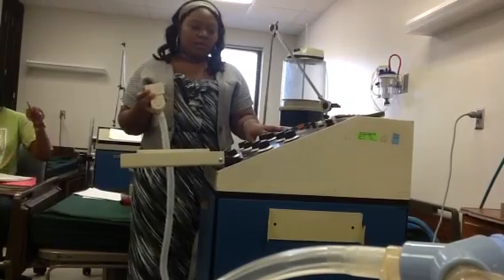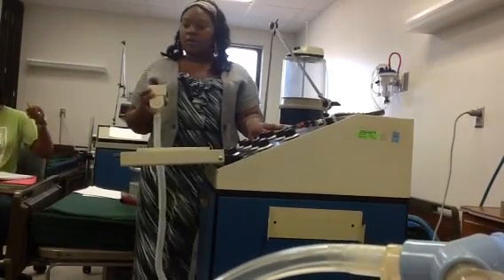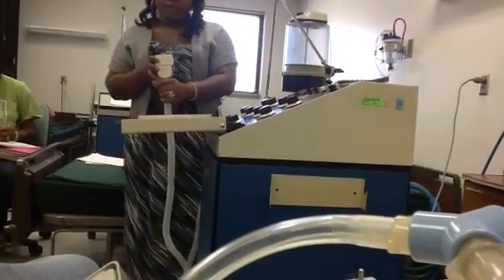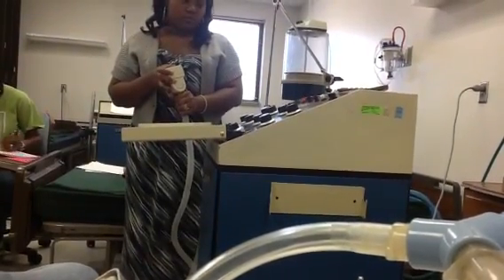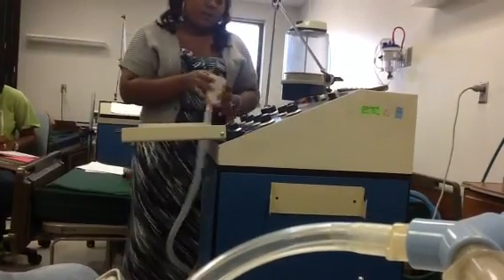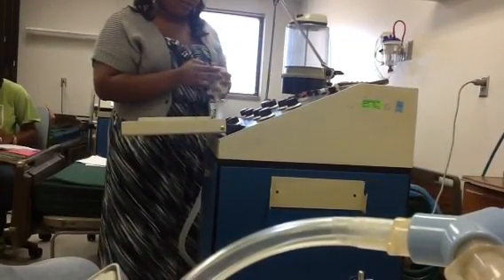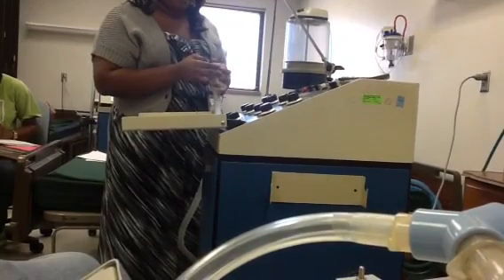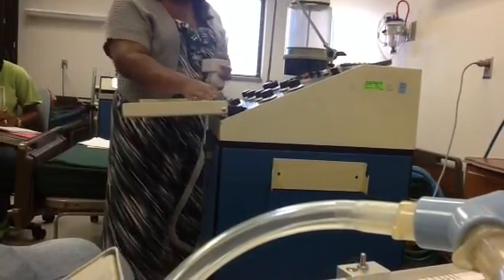Okay, breath, exhaling, okay, hold. This is 1.02. I don't think that's right. Hold on a second. That may have been a sigh breath. You need to make sure it's a regular breath and not a sigh breath.